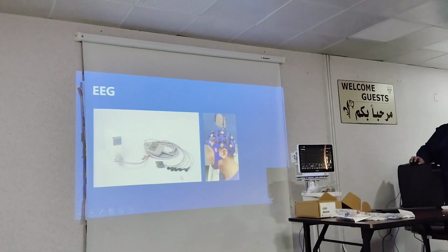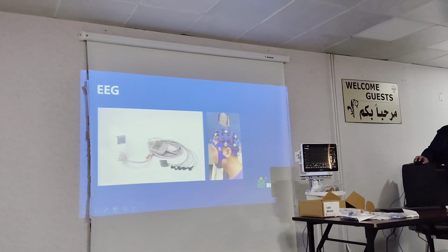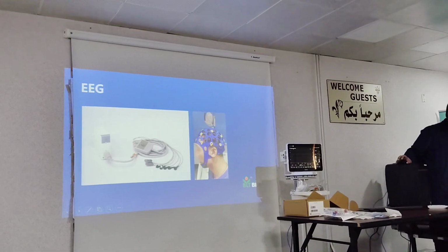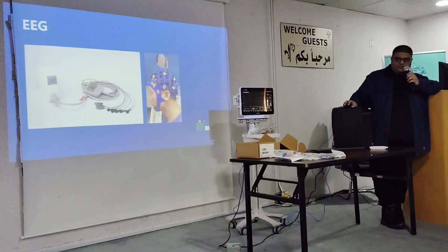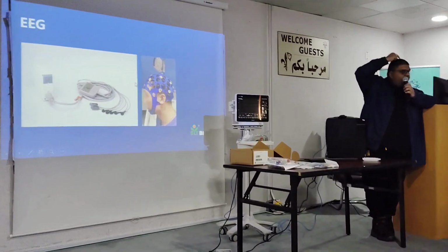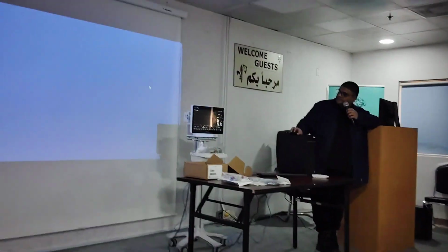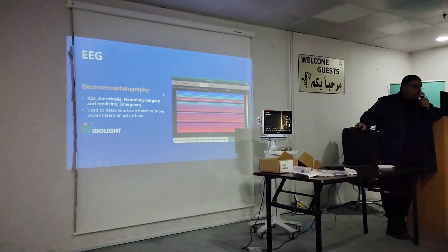This is your EEG that you were asking about. You can see that there are no electrodes here. These are cables. I mean, technically, yes, they are electrodes, but it's not the same disposable electrode, not that kind of thing. So this thing just connects to the cap over here. You just press it in, and then you insert a gel, and you're good to go. So it kind of works like this. So we have an EEG, we have DSA. You guys know what DSA is?